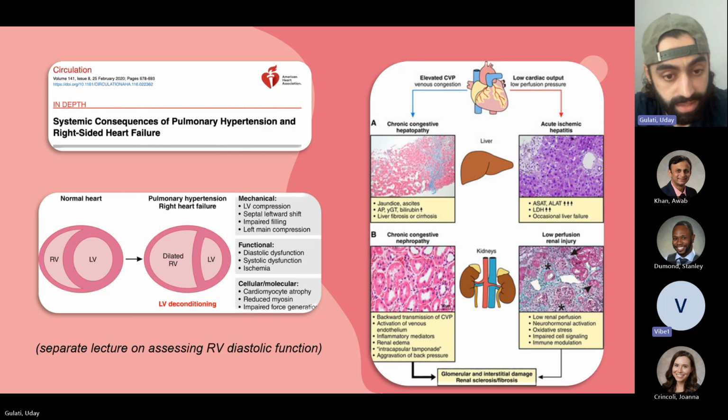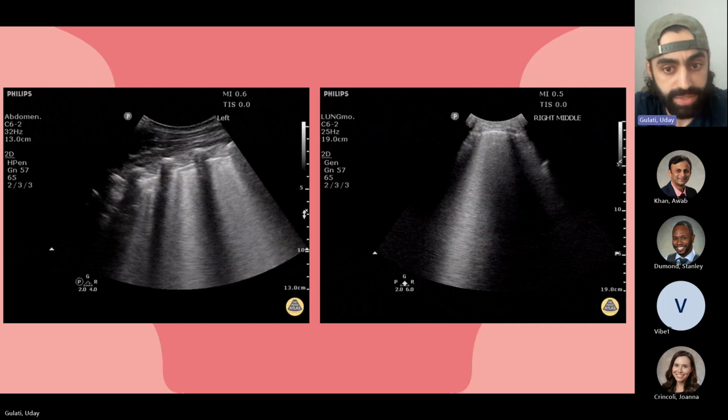In the same way that you can get ischemic damage from not getting enough fluid, you can get ischemic damage from too much fluid. A lot of you will look at B lines and decide, maybe if the patient has excessive B lines, then I cannot give excessive fluid. Just remember that in this type of acute setting, where someone came in for sepsis and you gave an excessive amount of fluids and now you have B lines, that's a very late finding.